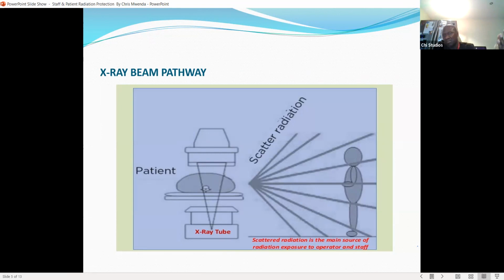Okay. So as I said, one of the big problems we have in the Cath Lab is scattered radiation coming from the patient. If you have got a big patient, there will be more scatter. The dose will go up. We have got some large pads which we have ordered, which can help you reduce scatter. I had a trial last week, so once we get the information in the near future, I'll try to talk about the large pads as part of radiation protection.